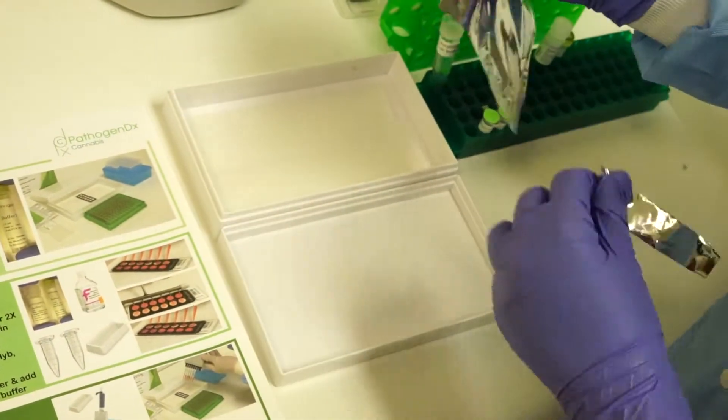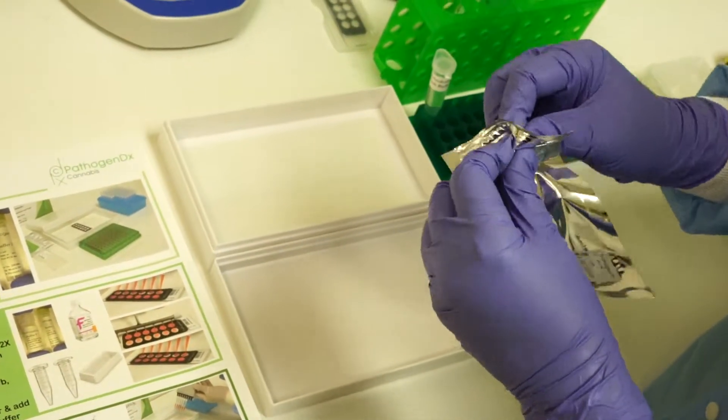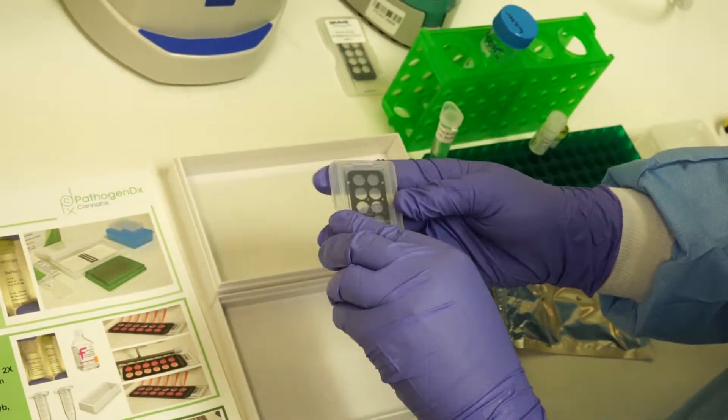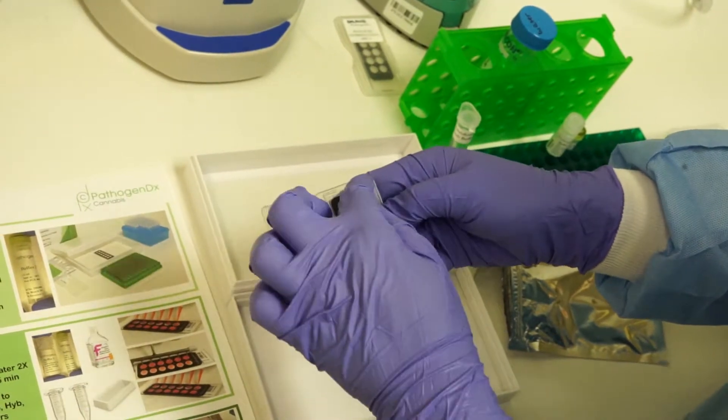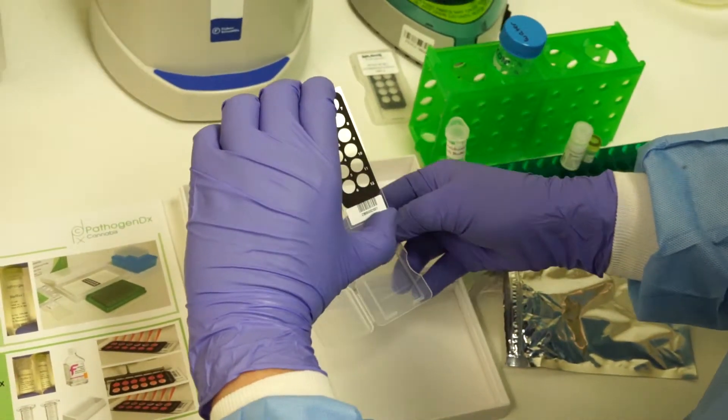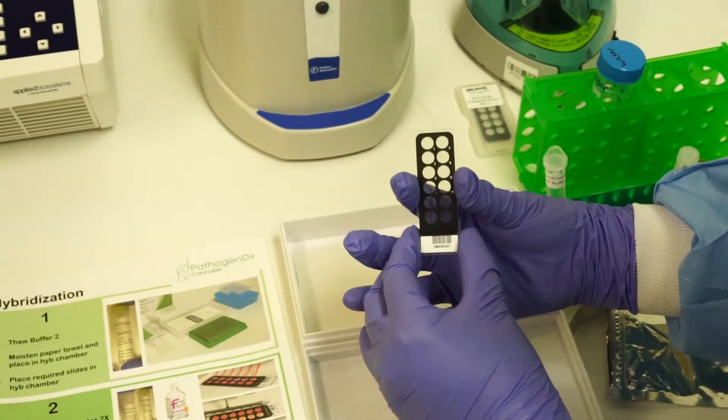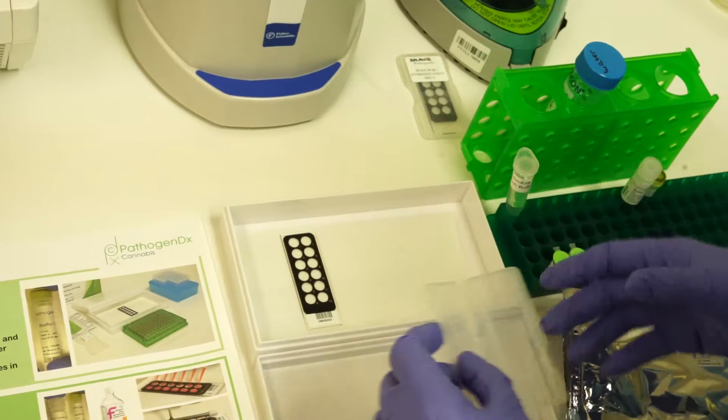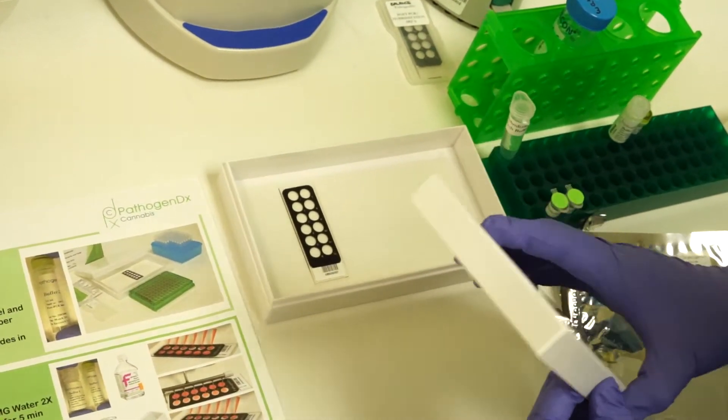Open your slide package and remove the slide from the foil seal. When handling the slide, avoid touching the surface. Use the edge of the slide or the barcode for handling. Place the slide onto the paper towel and close the lid until ready to begin.